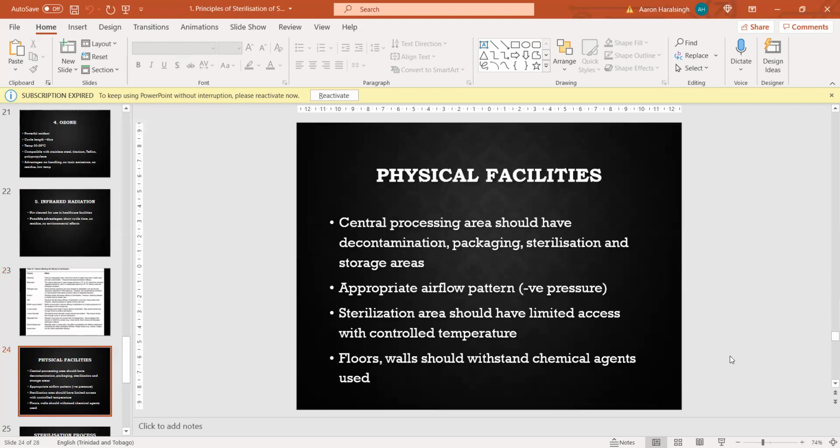Now, when an instrument, for example, falls onto the floor or becomes entangled in some sort of a mess, when a critical instrument becomes contaminated for some reason or the other, a number of steps need to be taken before we can get that instrument into sterilization.